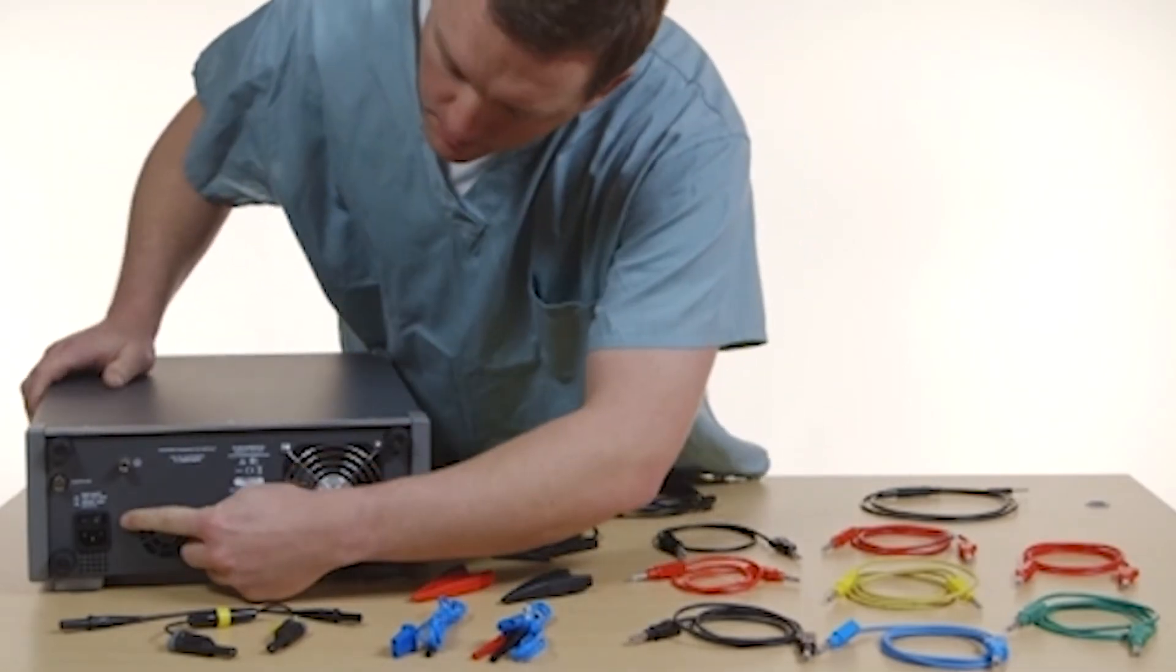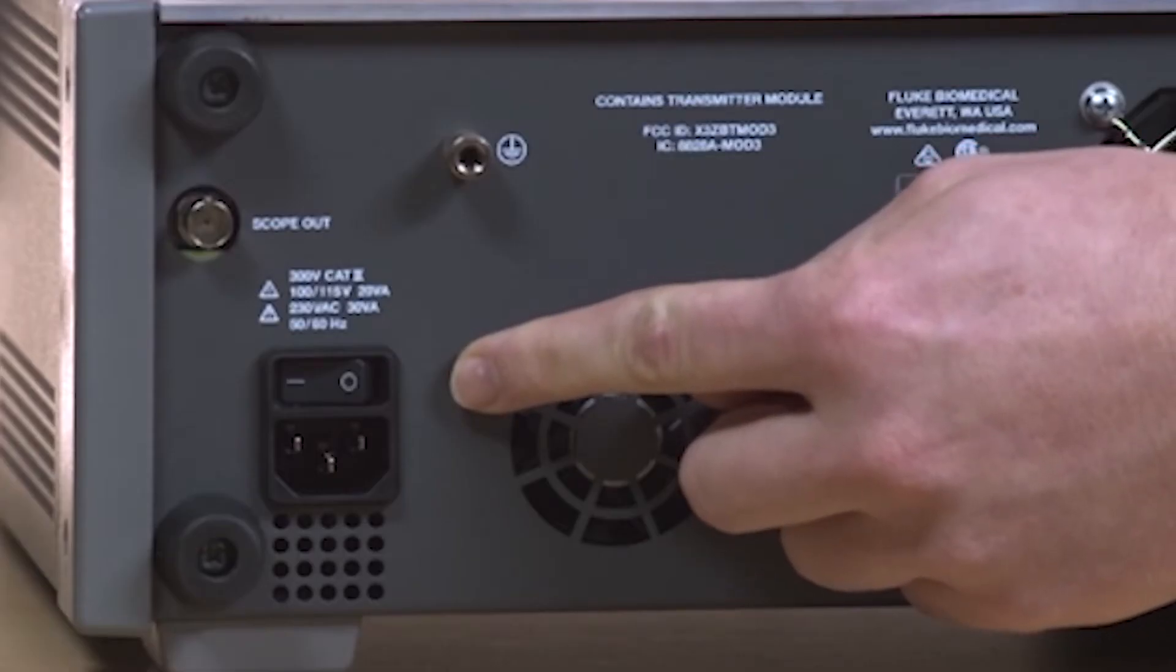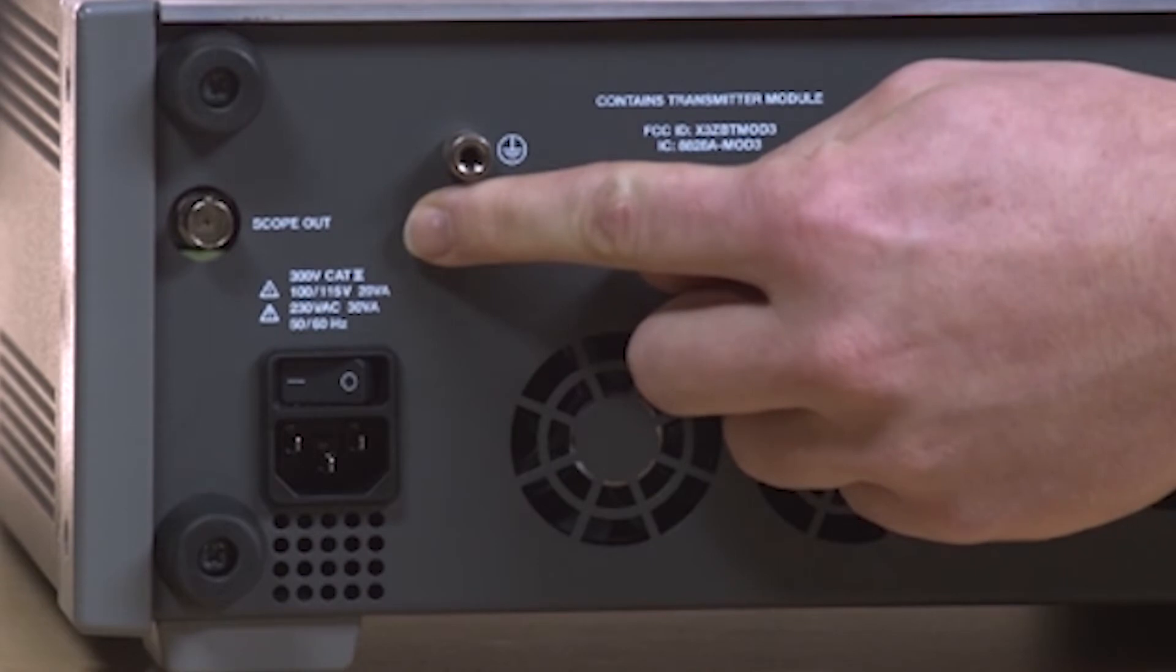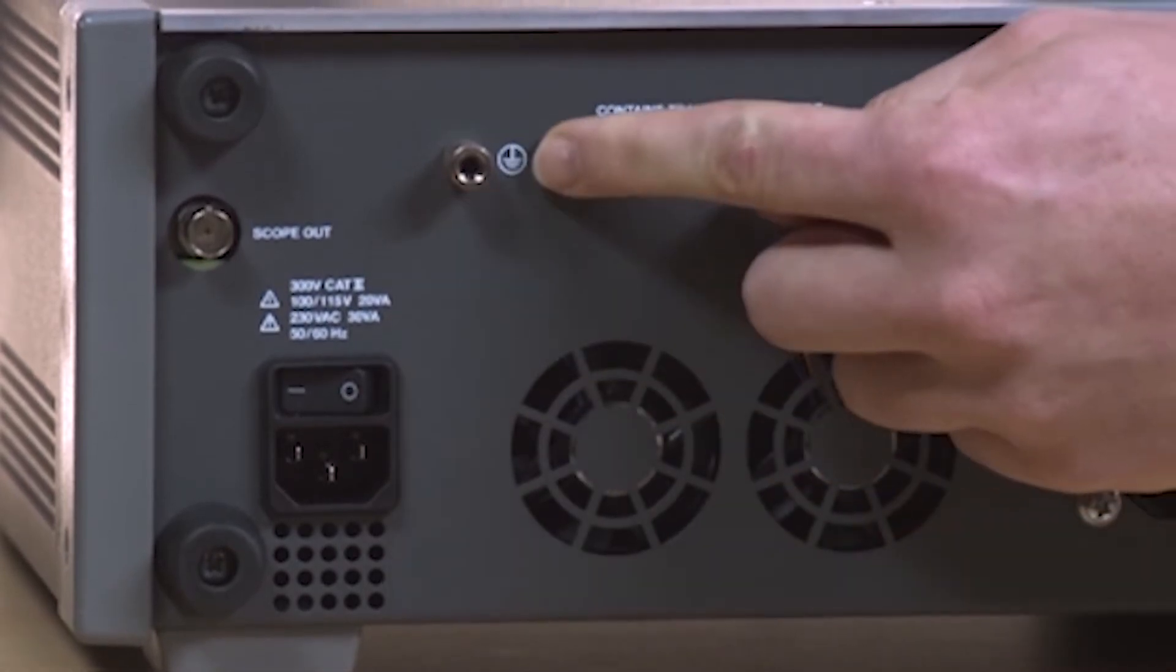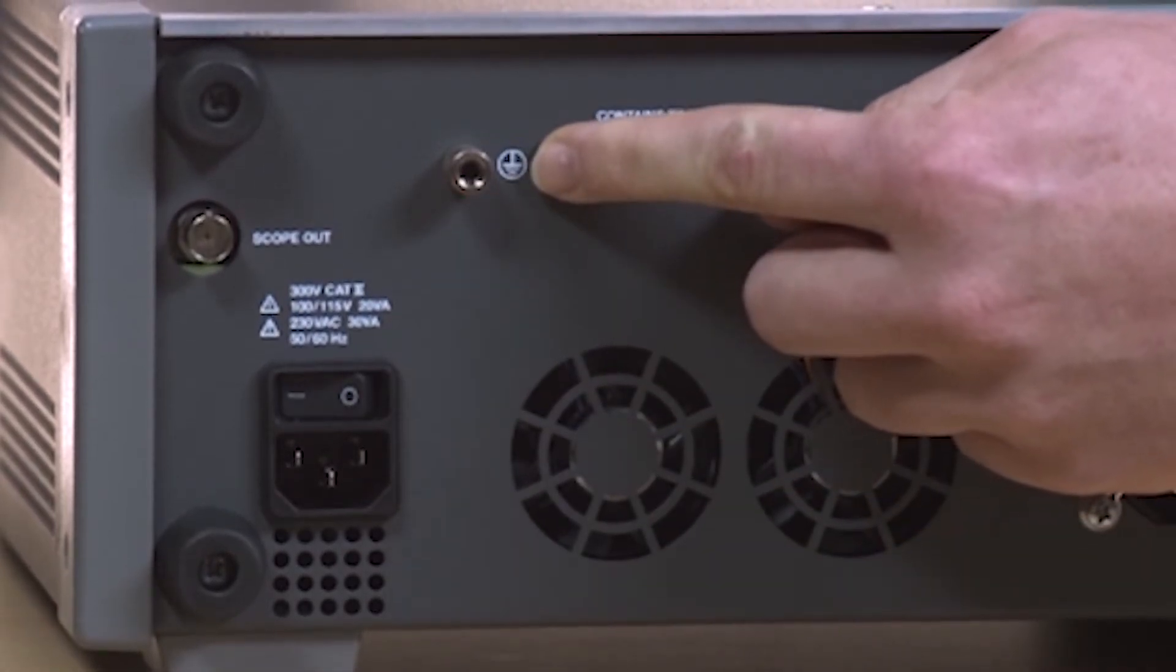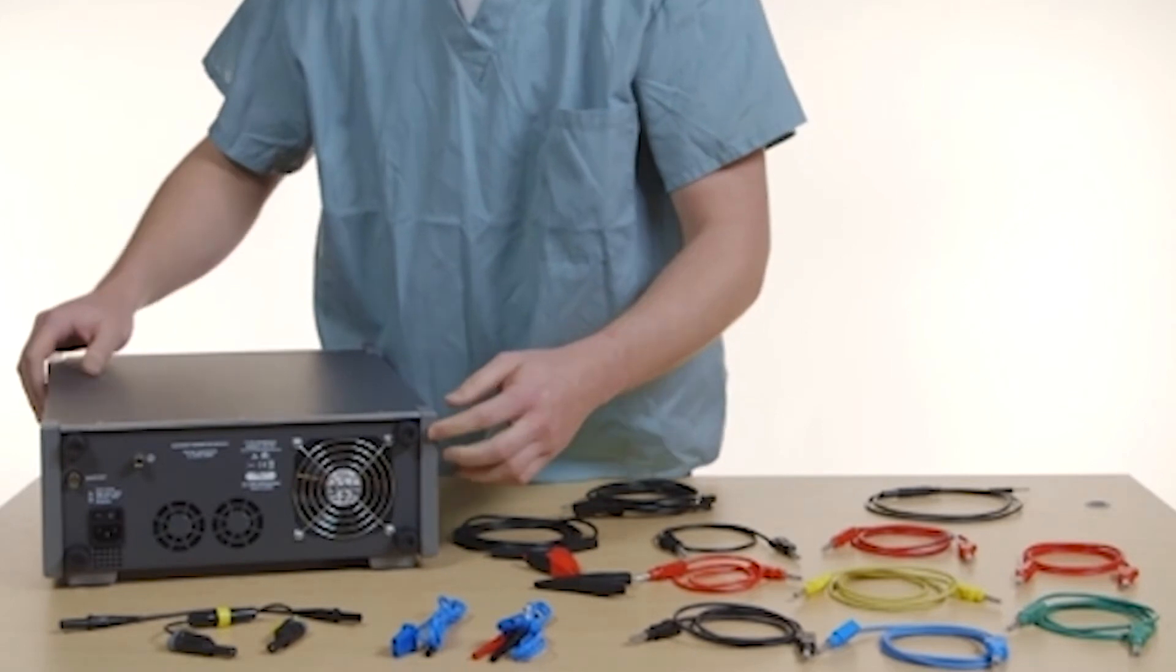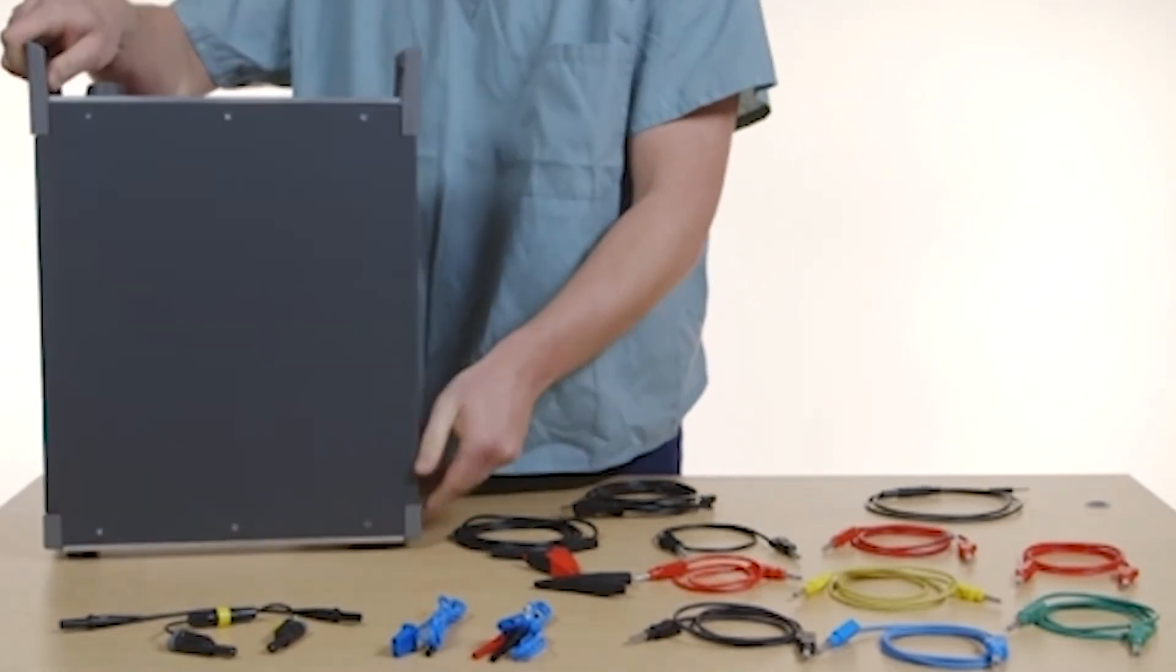The main power connection is at the back with an on-off switch. Here's the scope out for displaying the electrosurgical unit output power, which is the RF waveform on any oscilloscope. This is the ground lug. The bumpers protect the back of the unit if stood upright.